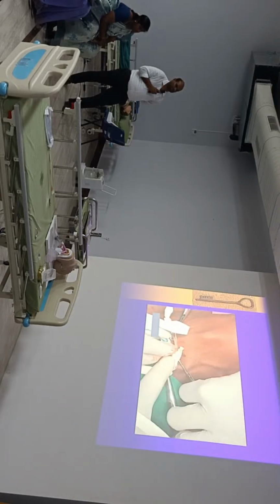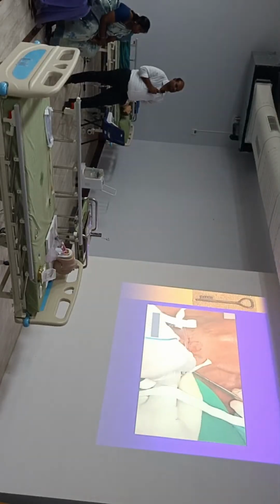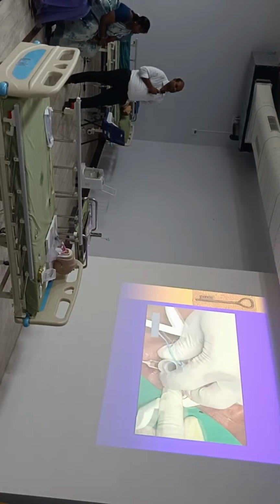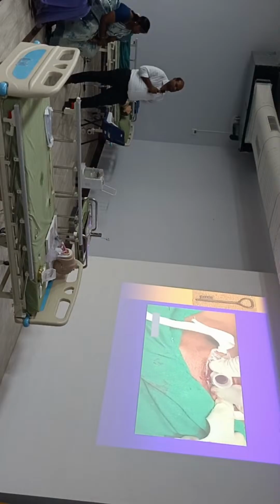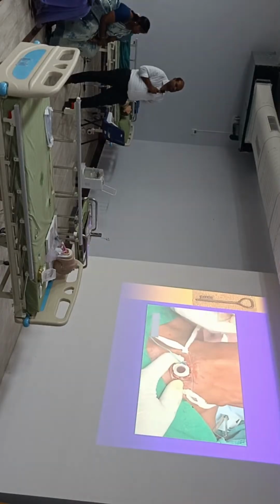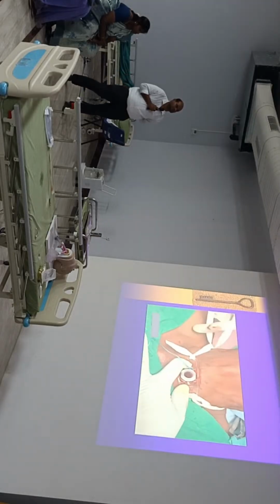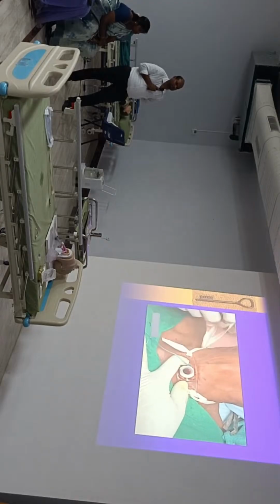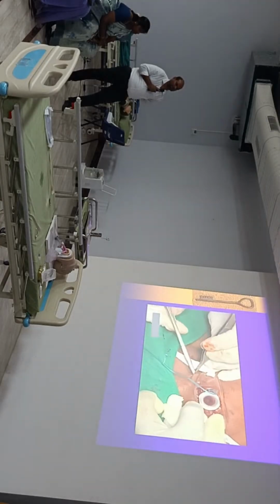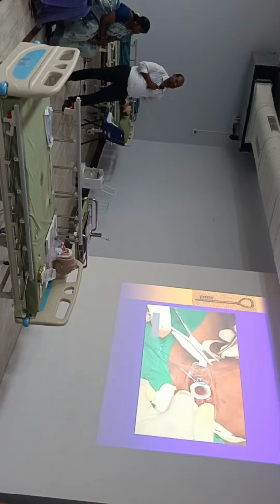We take the tracheostomy tube, remove all the retractors which supported it, and try the tube. This is a confirmation that the tracheostomy tube is inside the trachea. Make sure it is tightly tied. This is a case of emergency tracheostomy, so we have to be very fast or else we will lose the patient.